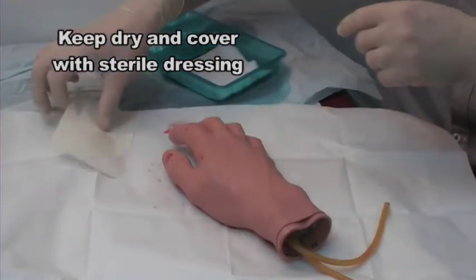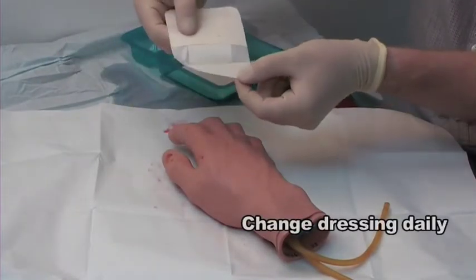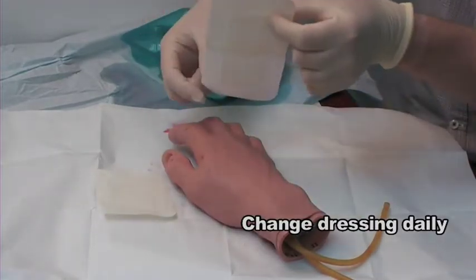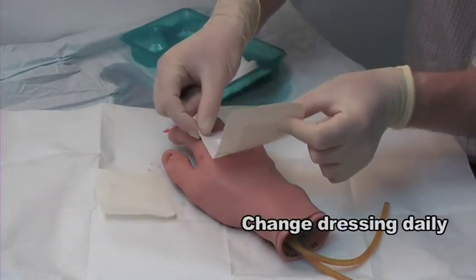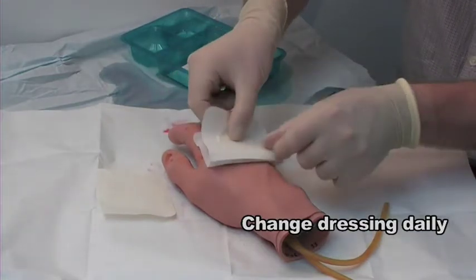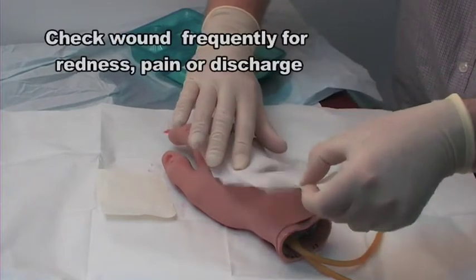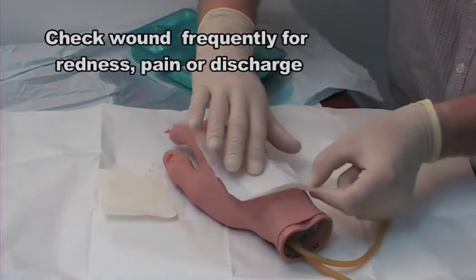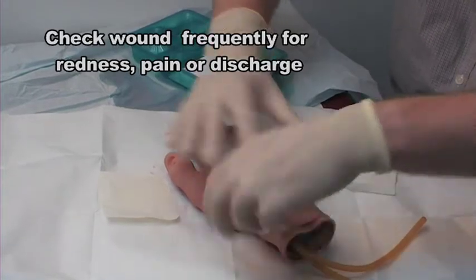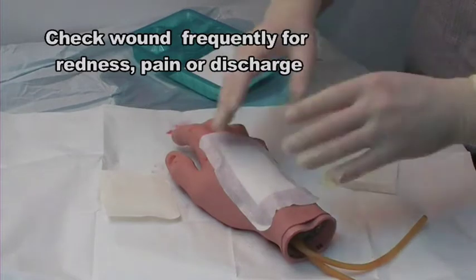The dressing has been opened onto the sterile field and I'm just going to peel the backing off one side without touching the actual dressing part. Apply that first half and then the second part — I just grip and pull down there, affixing the dressing to the wound without actually touching the wound itself.